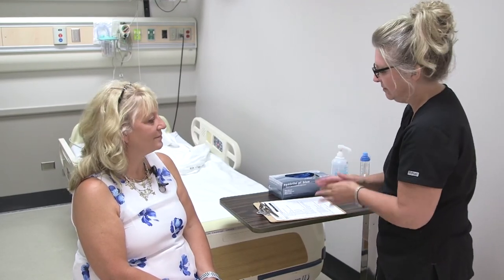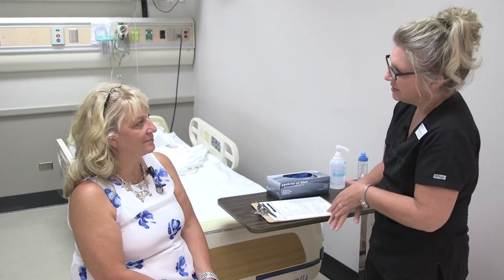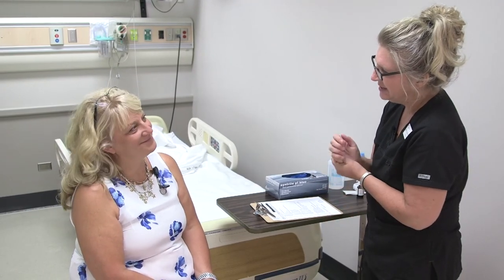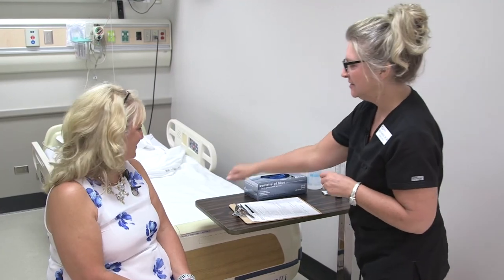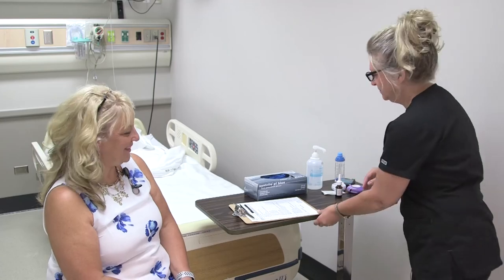Does it feel okay — any burning or stinging? Good. I'm going to wash my hands before I leave. Is there anything else I can do for you, Sylvia? No? All right — I'll be back to check on you in about 15 minutes to make sure everything is okay. Your call light is right here, so if you need anything just ring it. Thank you!